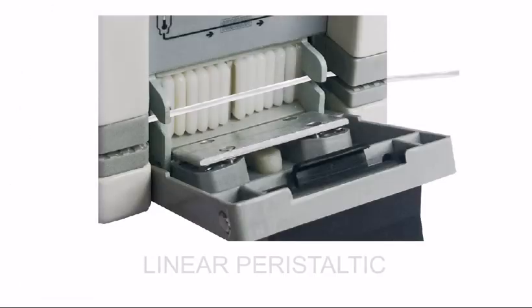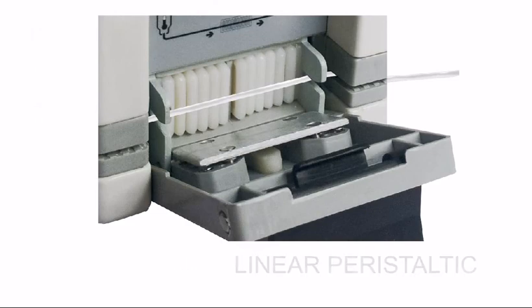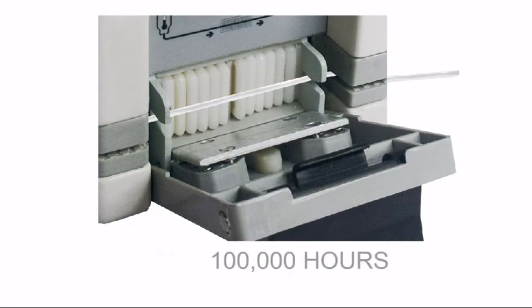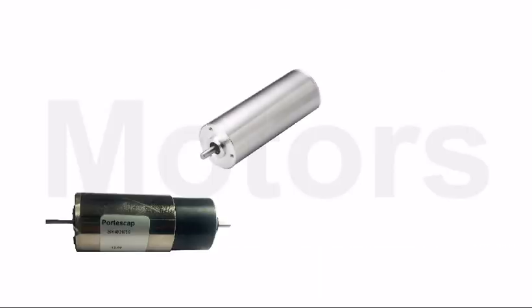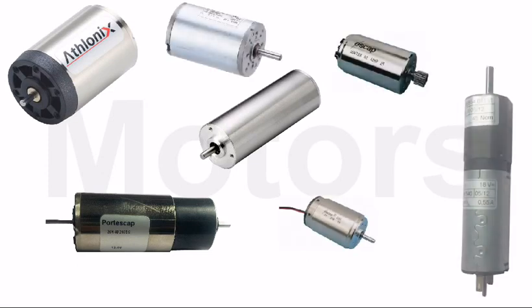Linear peristaltic technology ensures accurate flow without damaging the tubing. Materials used have minimal wear and tear and can run for 100,000 hours, which is more than 12 years of continuous running. The heart of the system — motors are imported from countries known for their quality standards, like Japan, Switzerland, and Germany.